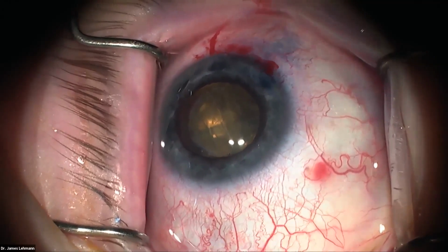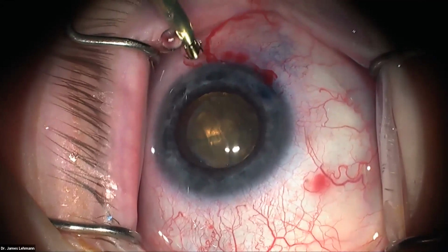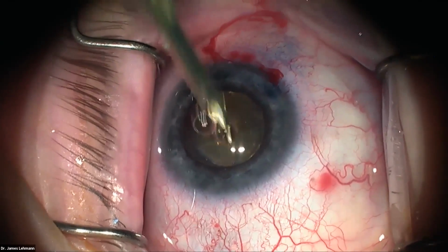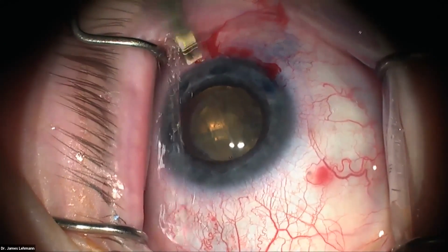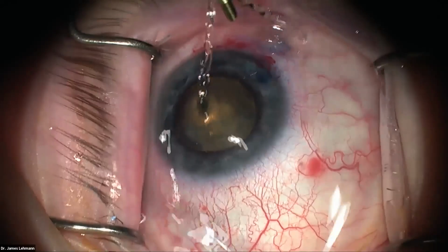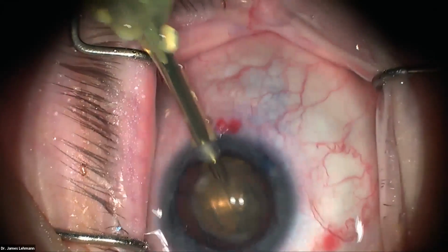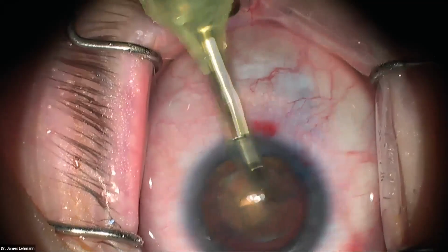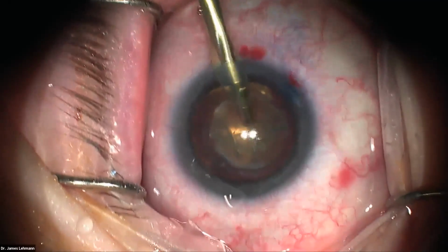Okay, so now we're going to start the phaco. And of course, we have different steps in phaco. First, we're going to sculpt. Now, the first part, the sculpt, the laser has already cut through and made quadrants for us. So we don't have to go down as far as we normally would with a normal phaco. So instead of having that like 80% depth, we can go down maybe just 50%. And I'll kind of show you that. I'll center this better. Put some BSS for me.